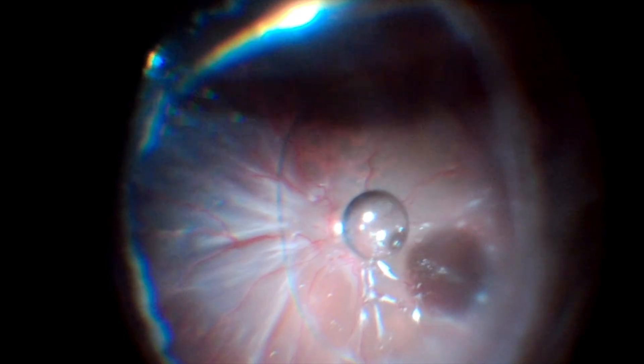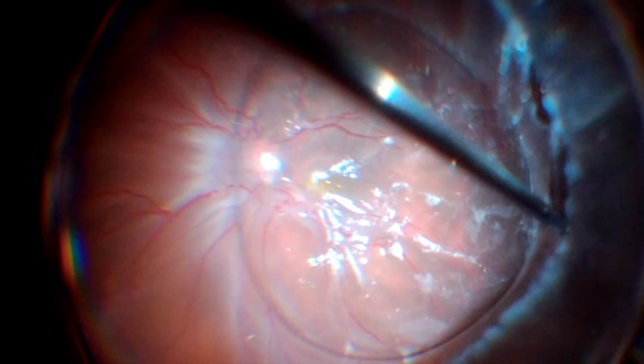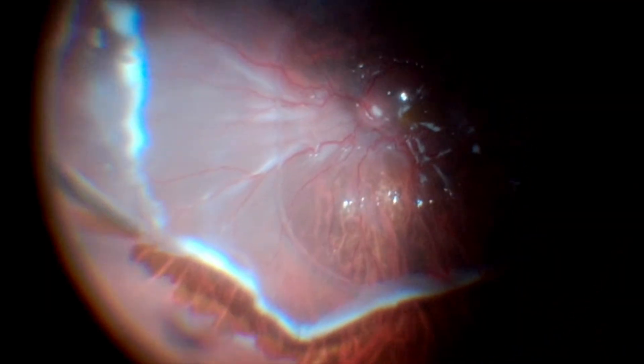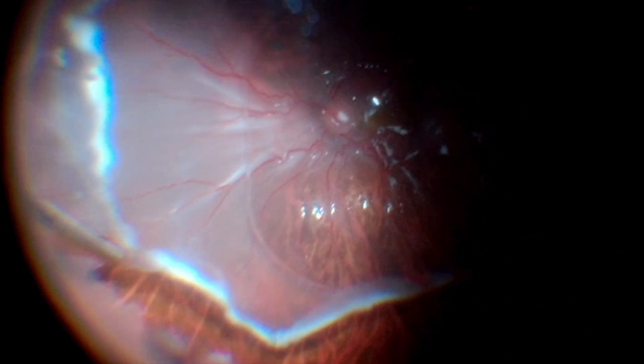For this, endocautery is used for marking. Endocautery is essential to prevent hemorrhages during the retinectomy. A 360-degree retinectomy is then performed using the vitreous cutter.